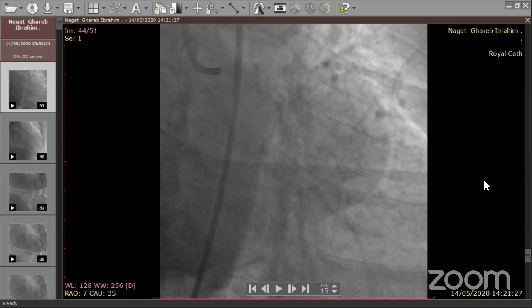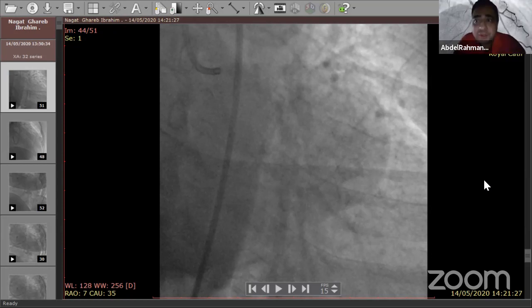But yes, Ahmed, if you did that in left main trifurcation, you do a three balloon inflation. Yes. So, you routinely do a three balloon inflation after doing a provisional stenting for left main trifurcation? Or a step kissing balloon, not a triple balloon kissing. I can do a step kissing balloon for the ramus and then a step kissing balloon for the left circumflex and the final kissing. Very good tips.